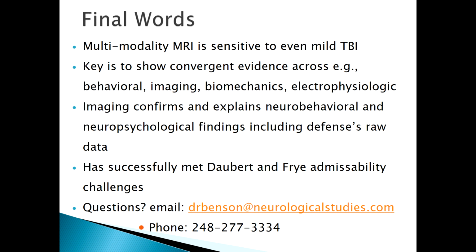And in fact, SWI is positive in around 30% of cases of persistent symptoms in clinically mild TBI.